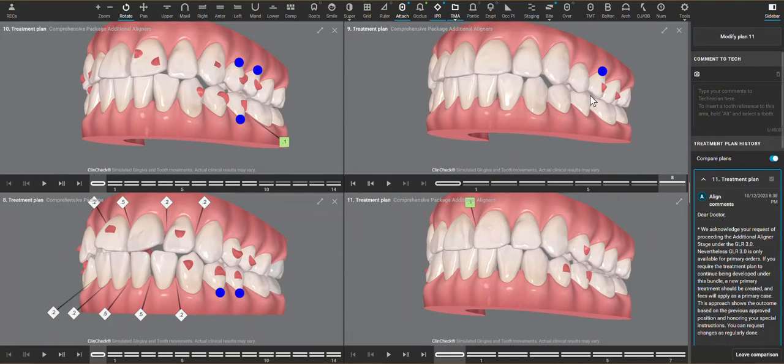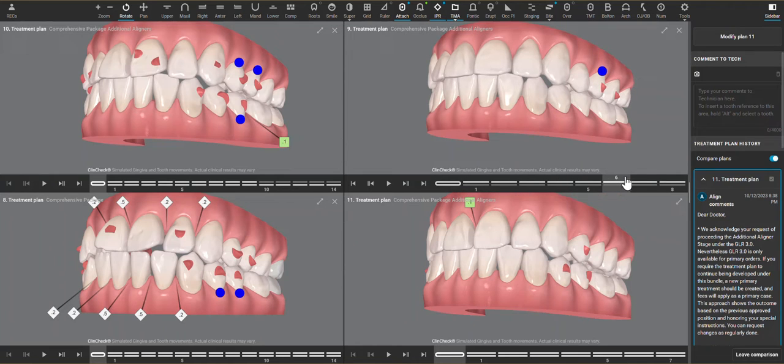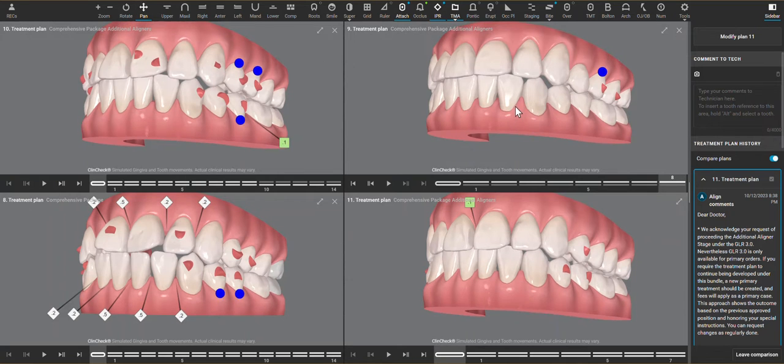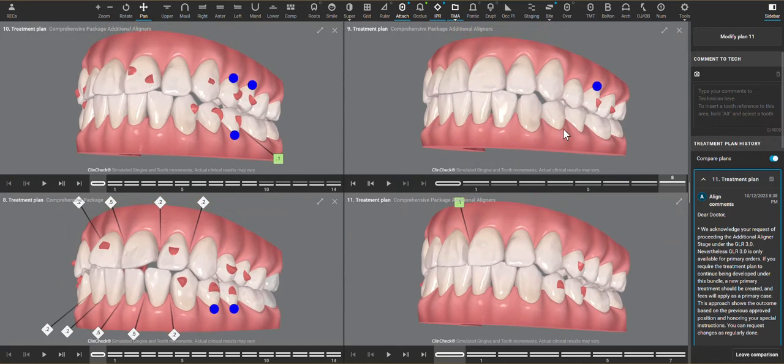The downside to it is that there was a fair amount of buccal movements being planned on the patient's left side in the posterior, and those may have contributed to the posterior open bite.